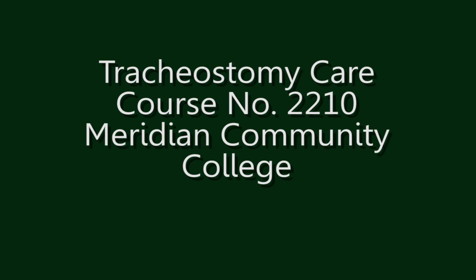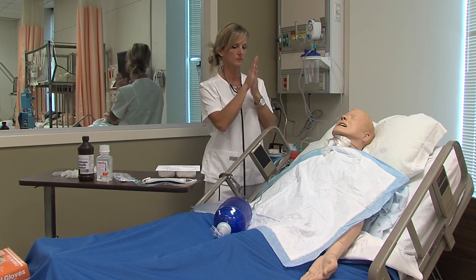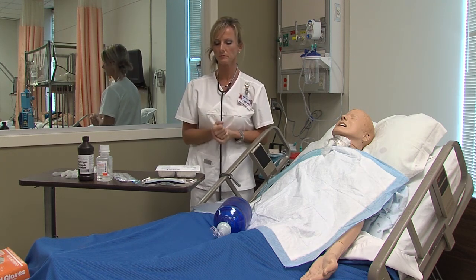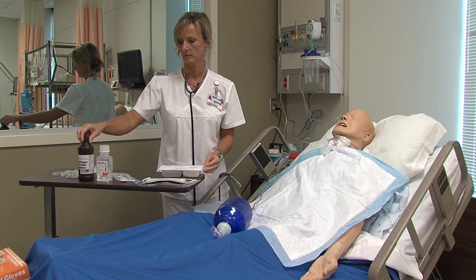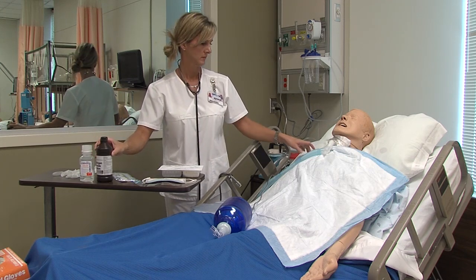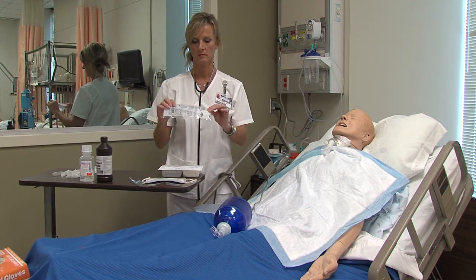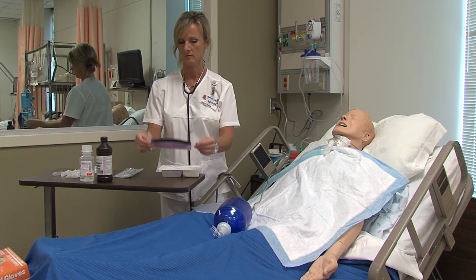This is the guide for Tracheostomy Care Procedure for Nursing 2210, for Full Room Hand Hygiene. Gather your equipment. You need a tracheostomy care kit, a bottle of hydrogen peroxide, a bottle of sterile saline or water, a clean towel or drape, a new tracheostomy tube holder, mask with eyewear, and clean gloves.